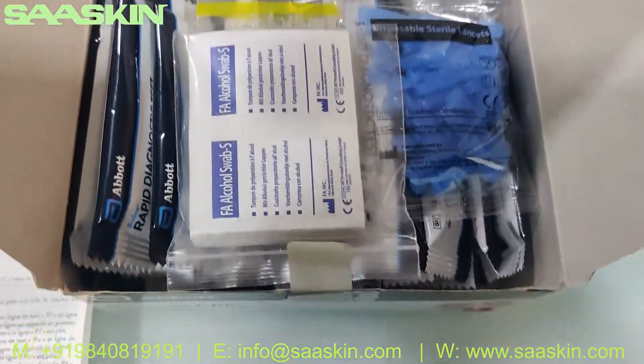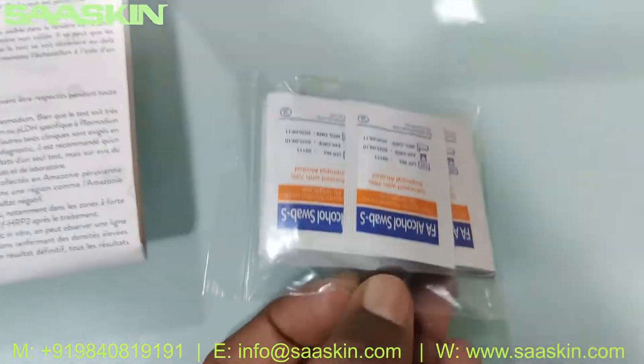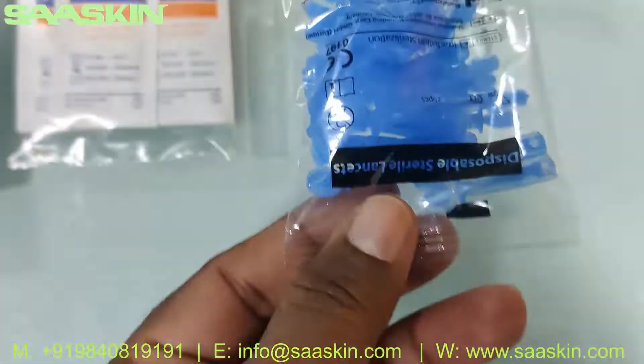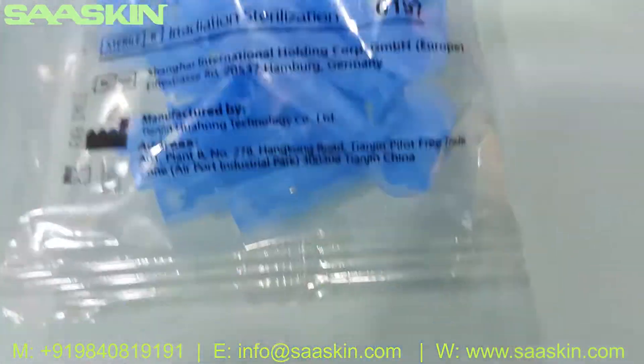Inside the box you have 25 pieces of alcohol swab — this is a 25-kit bag so you get 25 pieces of alcohol swab. You also get 25 pieces of lancet, as you can see here.